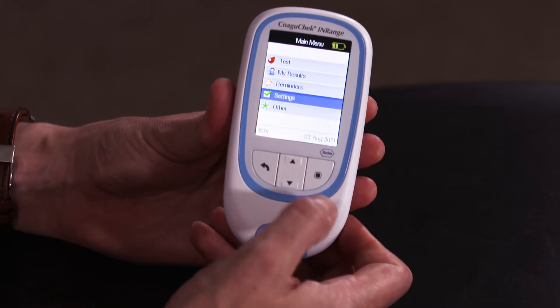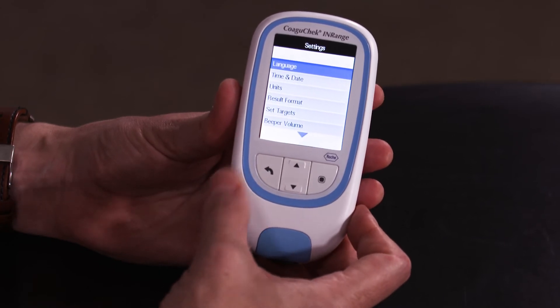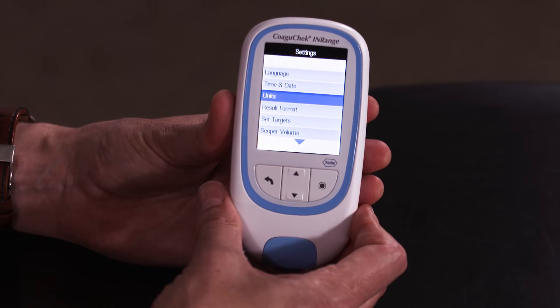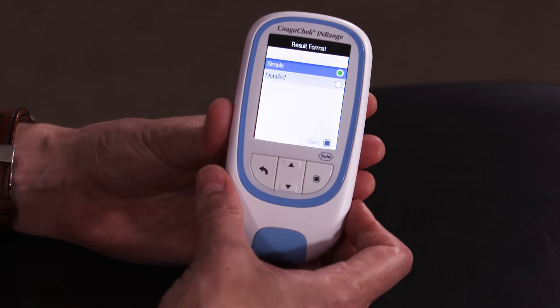To select settings use the navigation key and press the enter key. In settings you can change your language, you can change the time and date — it is important to make sure the time and date are correct. You can select the unit of measurement and the result format. In this option you can have a simple result format or a detailed result format. Please refer to the manual for further information.